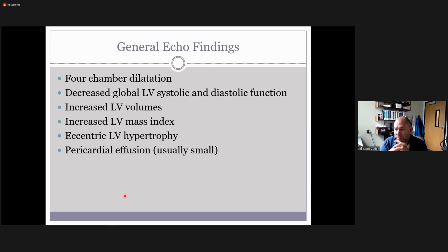When we get that compensatory hypertrophy, it's because the wall opposite of it is weaker than the rest of the walls and or scarred, which would then throw it into the diagnosis of ischemic cardiomyopathy. Okay, so the eccentric thing is just because it can be there, but it wouldn't always be. But your walls are squeezing altogether, and globally they're going to act and behave the same.